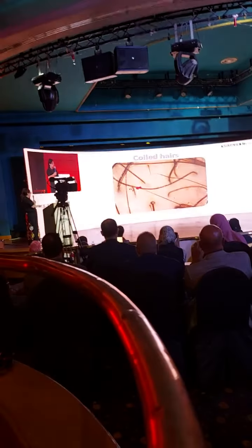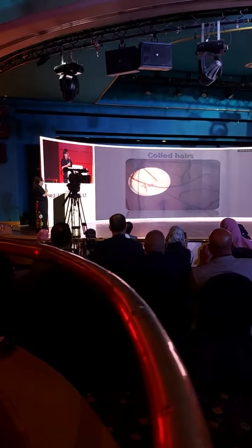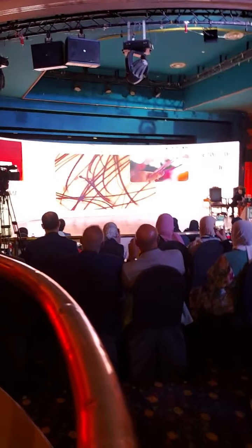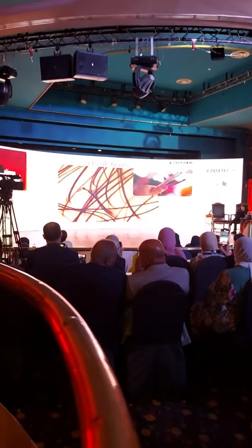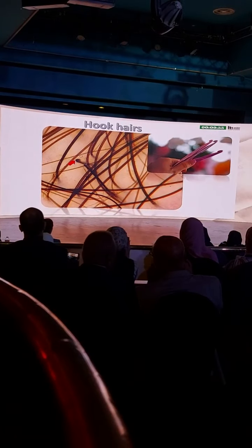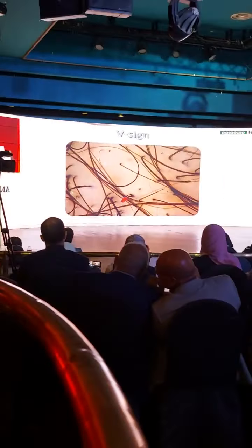Sometimes you can see some strange features. We can now call this feature also a coiled hair, but it looks strange. And a subtype of these coiled hairs, typical for trichotillomania, are hook hairs. They are coiled very tightly at the distal part of this short hair, so they are also known as question mark hairs.